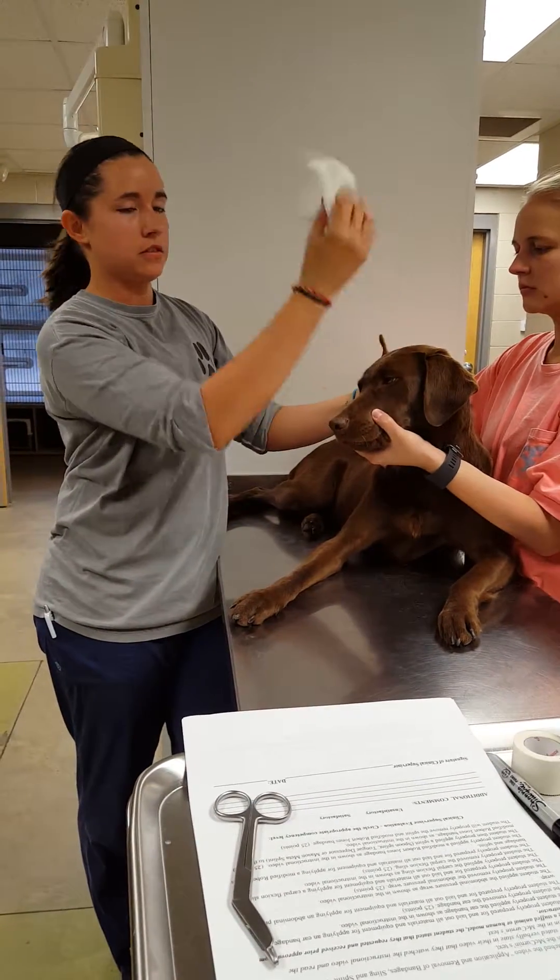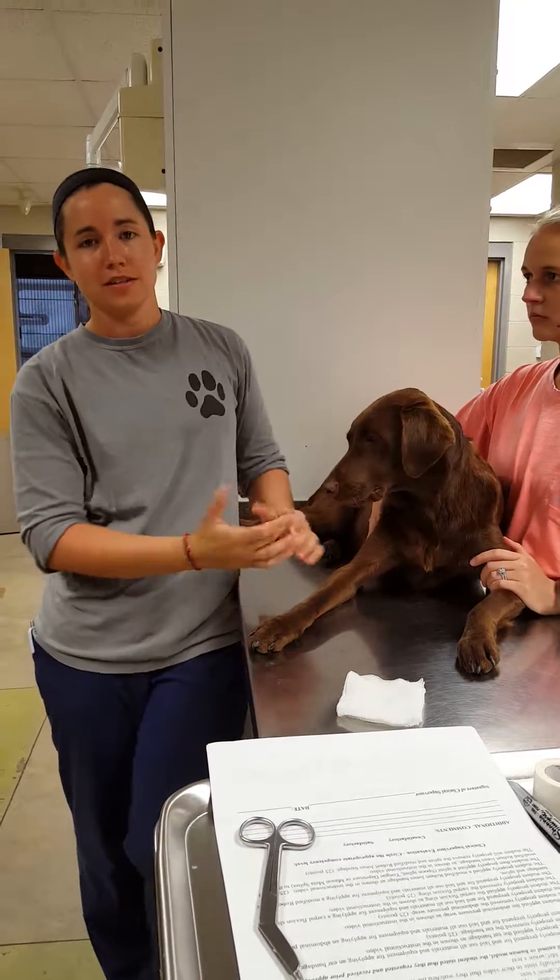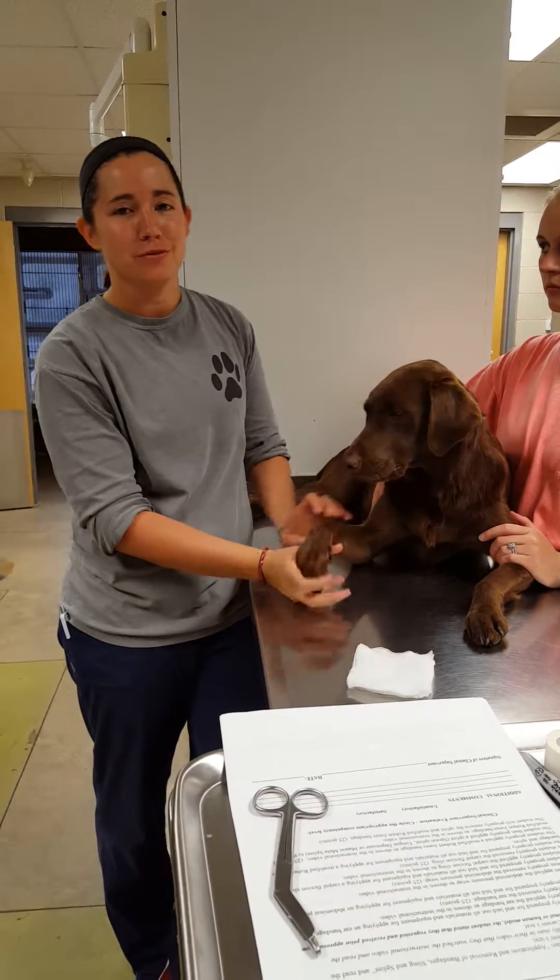The last thing I'll do is just take the gauze sponge off the ear and let it go. And that's how you apply an ear bandage and remove an ear bandage.